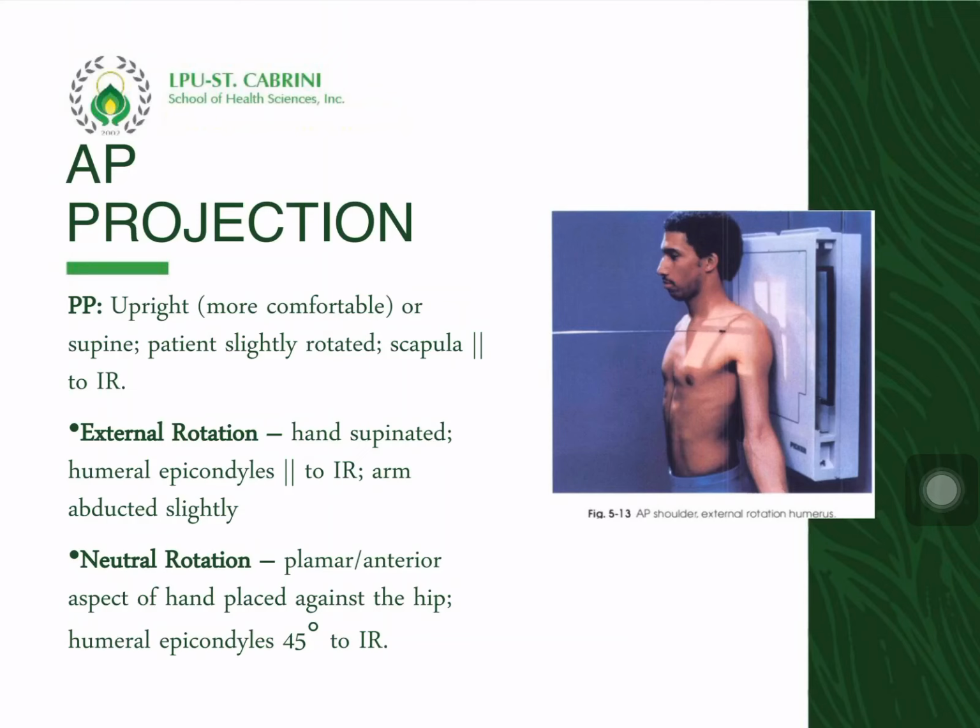We can also place the patient in a slightly rotated position if necessary to overcome the curve of the shoulder structures so that we can place the body of the scapula parallel with the IR plane. And if the patient is in supine position, support the elevated shoulder, which is the non-radiographed part, with sandbags.